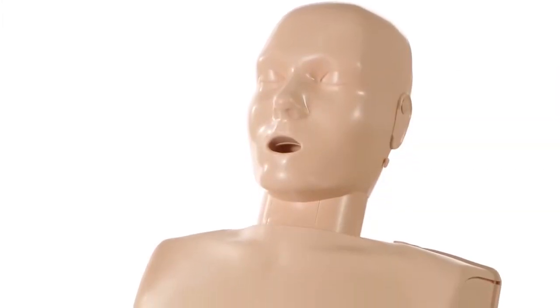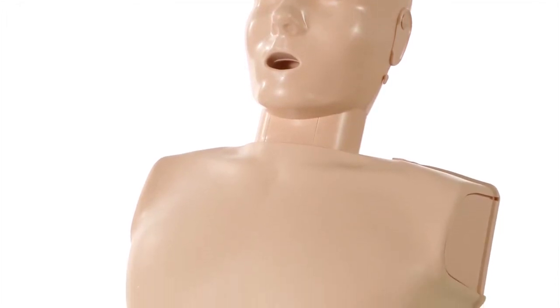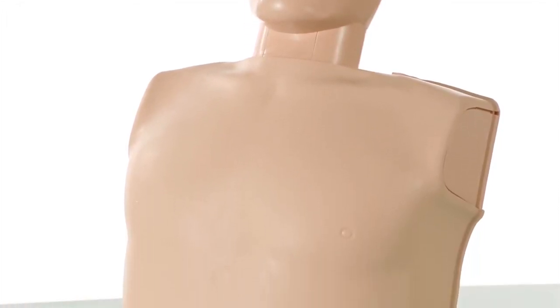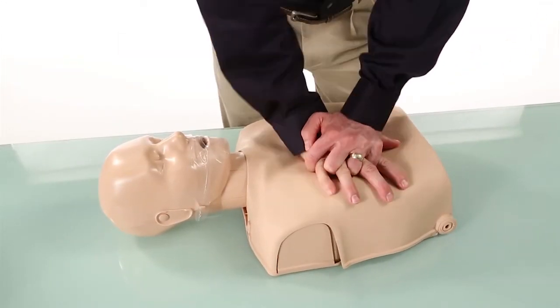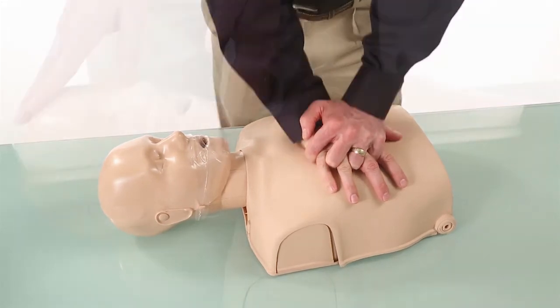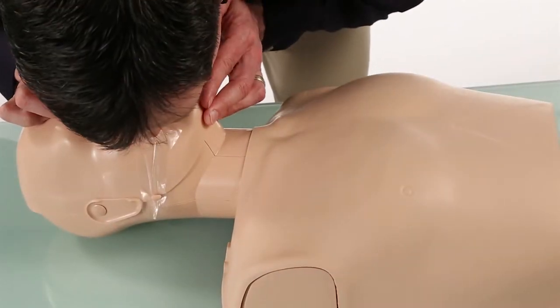As seen with other Preston mannequins, the Ultralight has anatomically correct features in the same realistic skin that is easy to clean. The piston allows for realistic chest compression resistance and depth, while a disposable lung bag gives a visible chest rise.